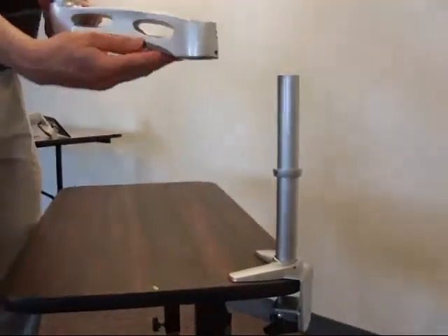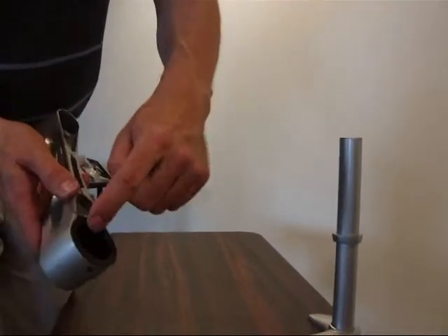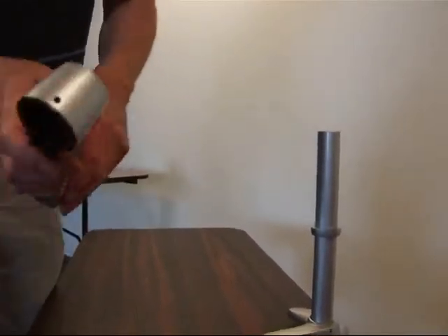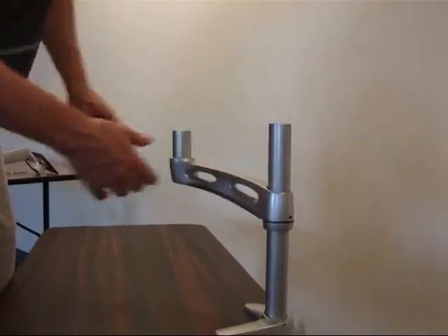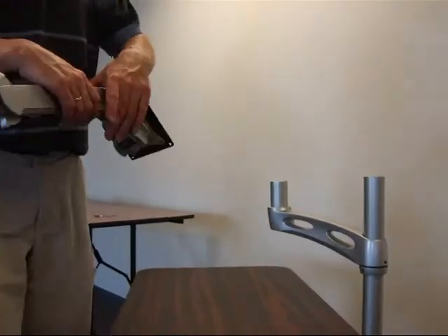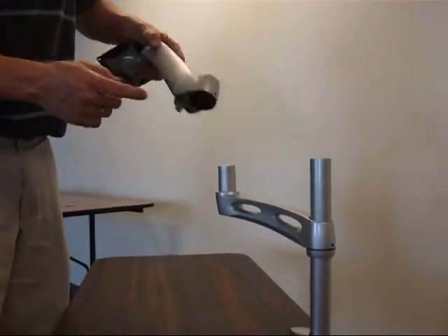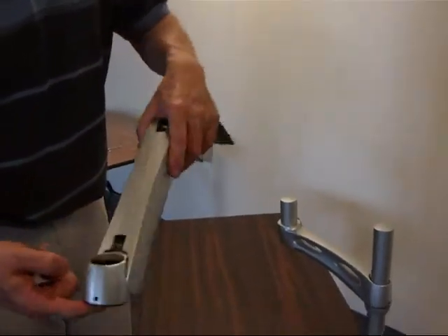Next step, I put my middle piece just in there. When you put it in there you want to make sure that that little black sleeve is in the hole for that middle segment, otherwise your arm is going to wobble. The third piece goes in the same way up here, and you also want to make sure that the sleeve is back in here.